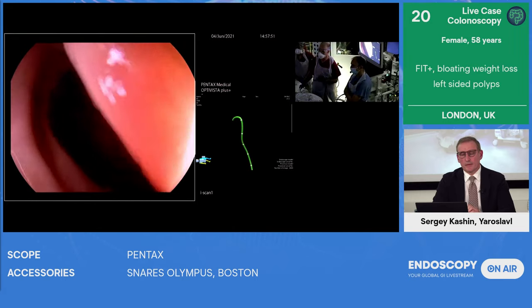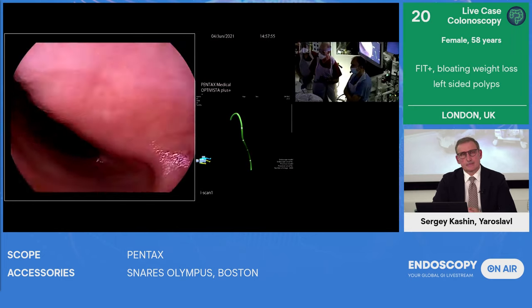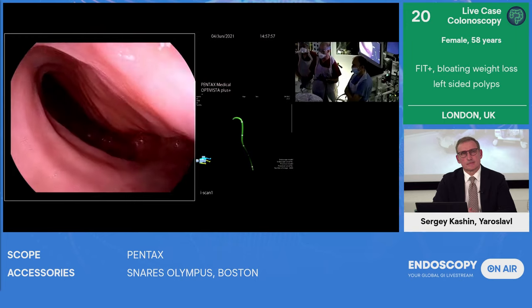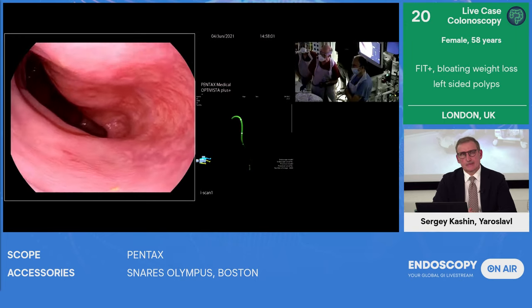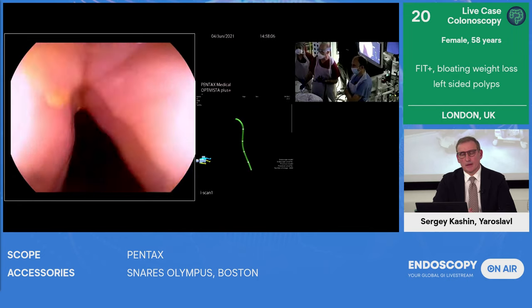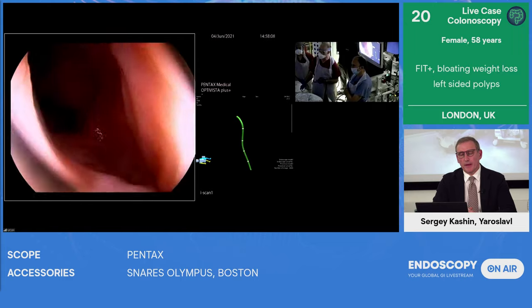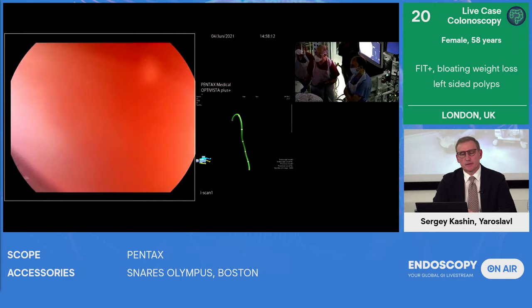For instance, I'll quite often move the patient over into the right lateral position for the cecum, and here the optimal position is over into the transverse colon. Actually, we're getting quite good views, so we don't really need to do that at the moment. But as we come back, a possible drawback of the system is the potential number of false positive results.